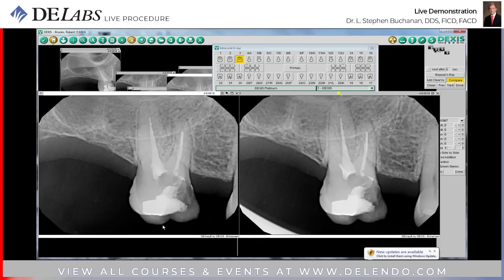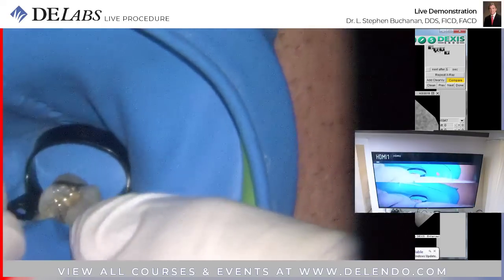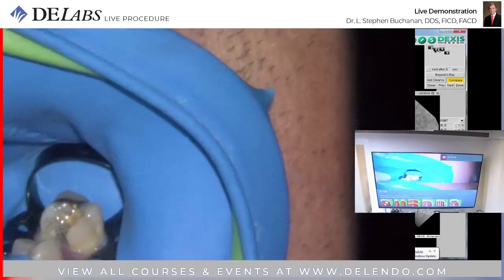Okay, so we're going to isolate tooth number 3. We don't have our new, are these our black clamps? Oh, nice. These are our new black clamps. Was this designed to be slit down with the bicuspid? Yes. Okay, good. So you want to use a wing clamp. You want serrated clamps because then it's just a cinch to use them.